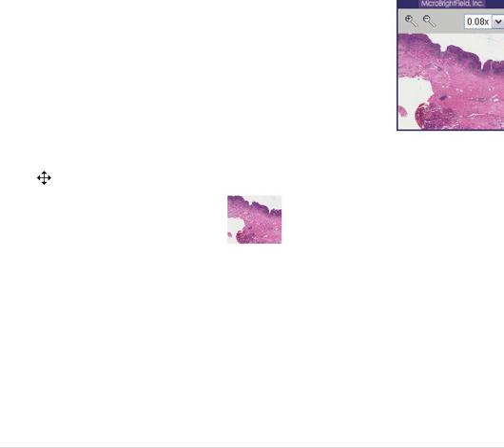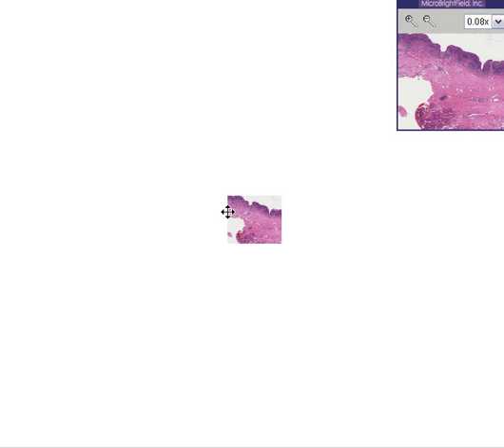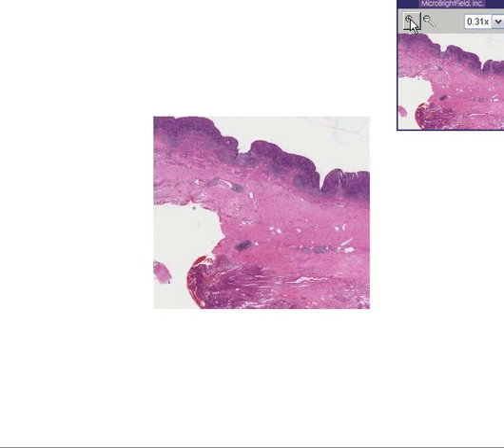Now we'll talk about the next case called chronic esophagitis. Here we see a strip of tissue in which, even at this power, you could tell one end looks a little bit bluish or darker, and then we see a bunch of fibrous tissue, and then we see the other side of the wall.